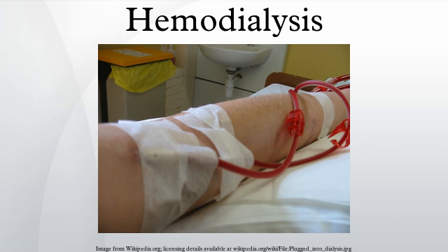Prescription. A prescription for dialysis by a nephrologist will specify various parameters for a dialysis treatment. These include frequency, length of each treatment, and the blood and dialysis solution flow rates, as well as the size of the dialyzer. The composition of the dialysis solution is also sometimes adjusted in terms of its sodium, potassium and bicarbonate levels.